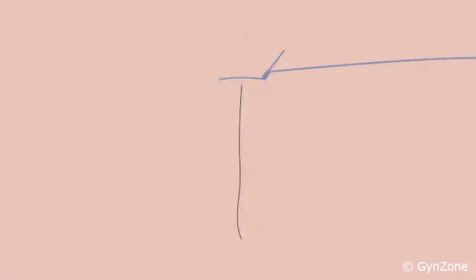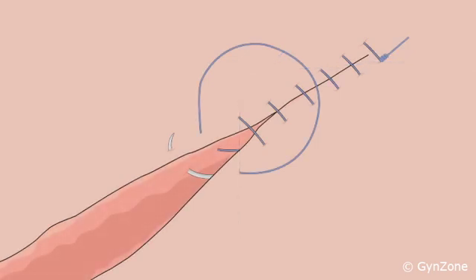If you cut both ends of the thread, the knot will become undone. The stability of the long thread end, which continues to suture the tissue, ensures that an even pull on the knot is maintained. Therefore, the knot can only be used at the beginning of the continuous suture.